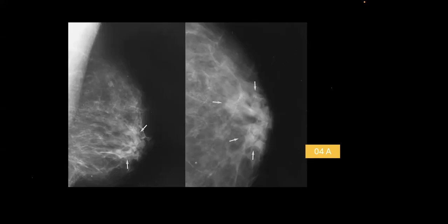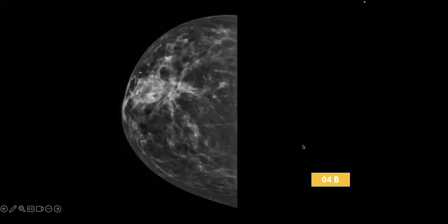It can be of the same pathology or it can be different also. That we'll discuss later. This is 4B.